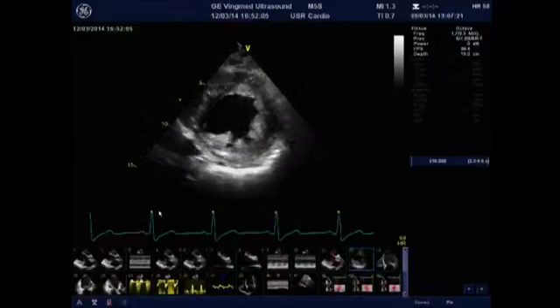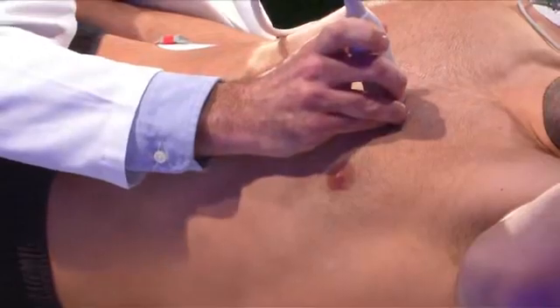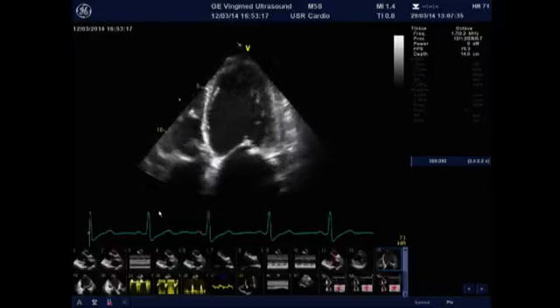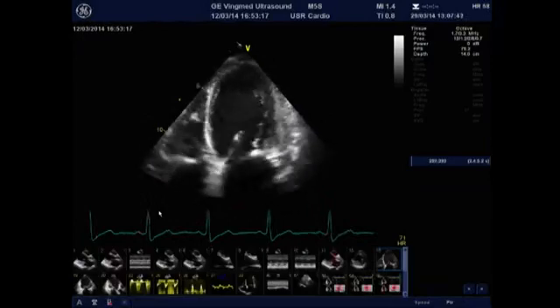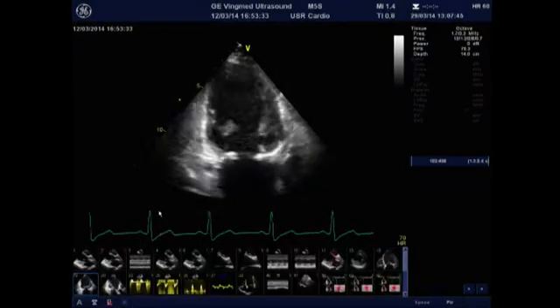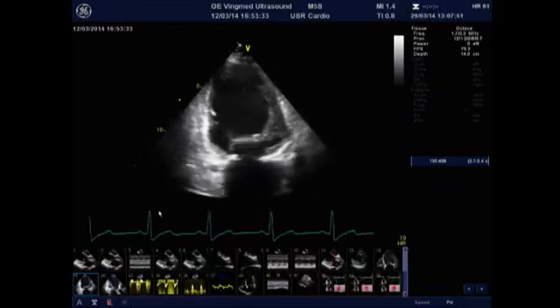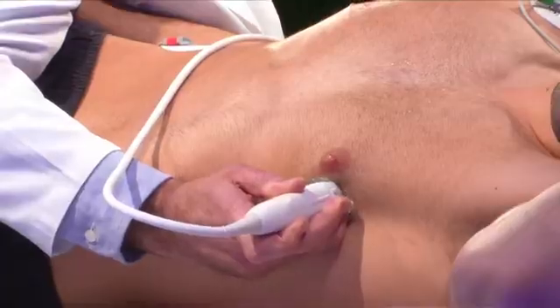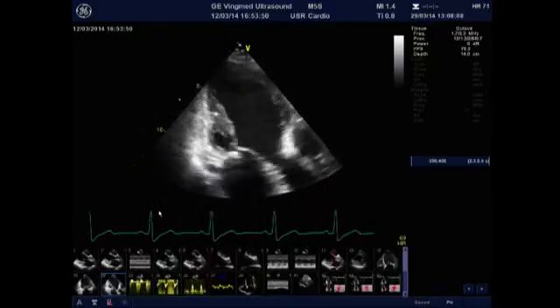I would say mild to moderate in our eyeball assessment. When we turn to the four-chamber view, again, I would say a mildly depressed LV systolic function, confirmed in the two-chamber view. I would say the inferior wall is akinetic. Perhaps he had an inferior myocardial infarction. And the three-chamber view confirms our overall previous impression.